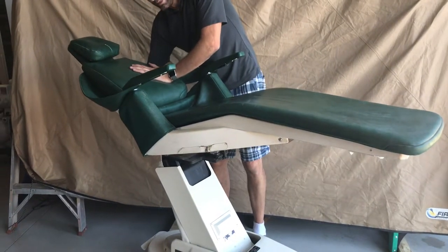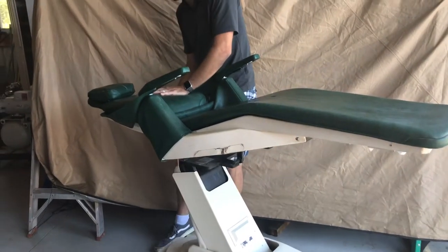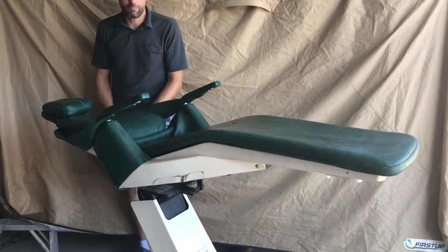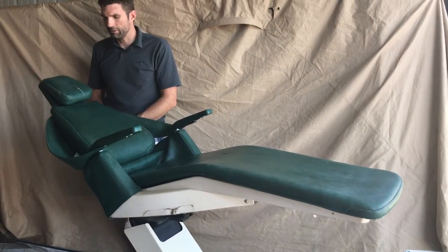It has full functionality and you can access the controls from both sides. Bring the patient all the way back. It has a down motion too, all the way down, and it goes really low — you'll see how low it will go.